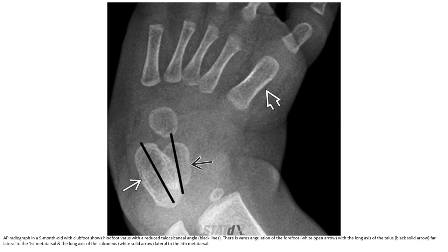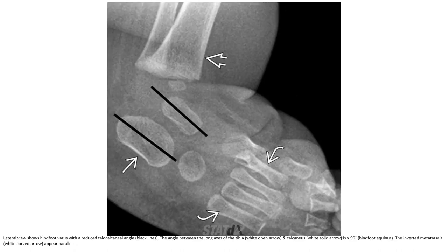An AP radiograph in a neonate with clubfoot shows hindfoot varus with reduced talocalcaneal angle. There is varus angulation of the forefoot with the long axis of the talus medial to the first metatarsal and the long axis of the calcaneus lateral to the fifth metatarsal. On lateral view, hindfoot equinus is present with the angle between the long axis of the tibia and calcaneus more than ninety degrees. The inverted metatarsals appear parallel.